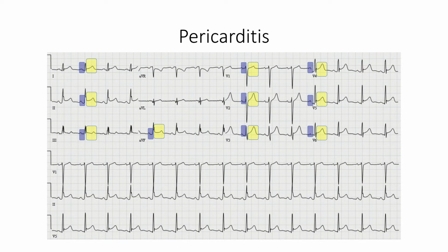So on tests that you'll have, pericarditis is often mixed with answer choices of ischemia. So in this situation, you really need to think about your groupings of different leads, like the lateral leads, which are leads 1, AVL, V5, and V6, or the anterior leads, which are V1 through V4, for example. If you're having multiple distributions affected with PR depression, you may very well have pericarditis and not ischemia. This is important to test examiners because the treatments and the prognosis is vastly different. In a patient with pericarditis, maybe they had rheumatoid disease or renal disease, and then you see the ECG. Don't choose ischemia if the story is more suggestive of pericarditis.